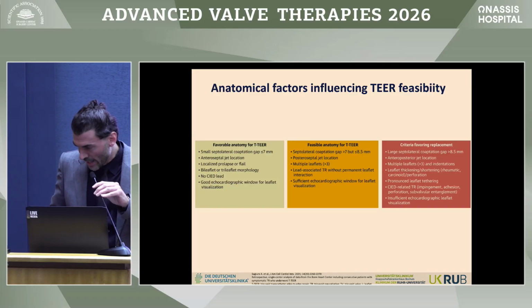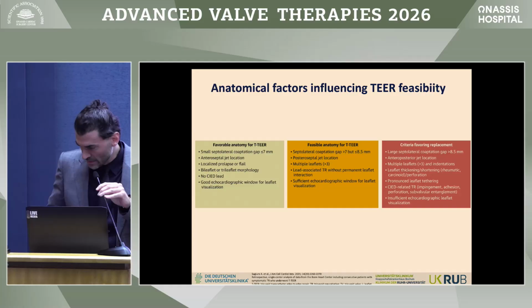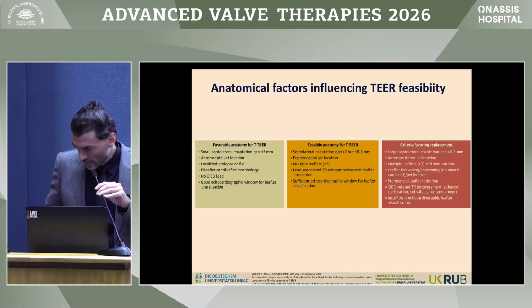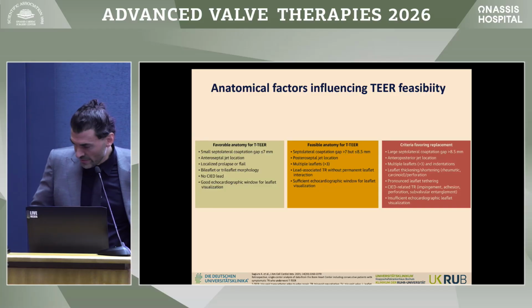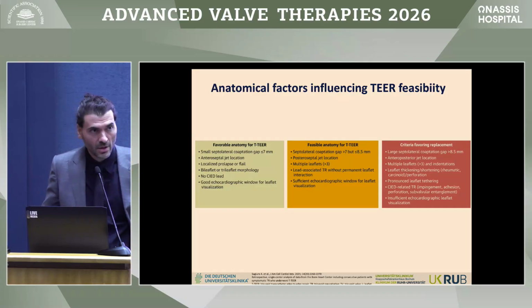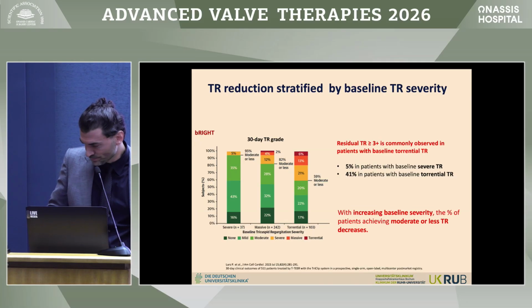You have also the gray zone. We have a gap of 7 to 8.5, or a posterior septal jet is also feasible, and definitely we can also have a pacemaker in the tricuspid valve. If the leaflet is not being bothered, we can still try it. If that is not the case, then we should consider replacement and go further with other screening via CT.